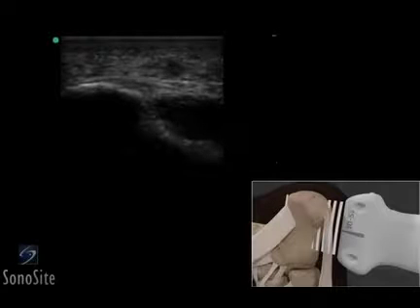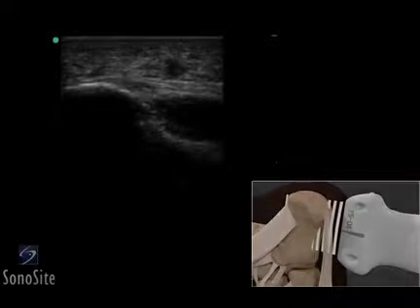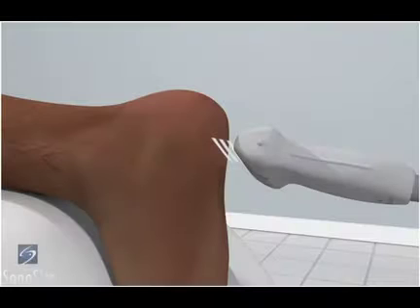A linear array transducer with a musculoskeletal exam type is used to perform an ultrasound examination of plantar fasciitis. The patient is placed in a prone position with the foot extending beyond the bed and positioned in a neutral position.